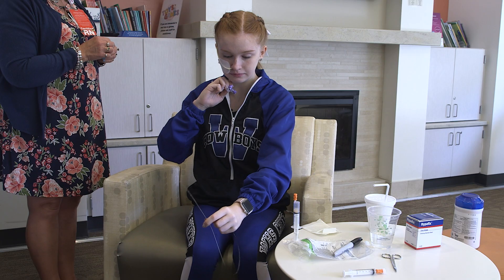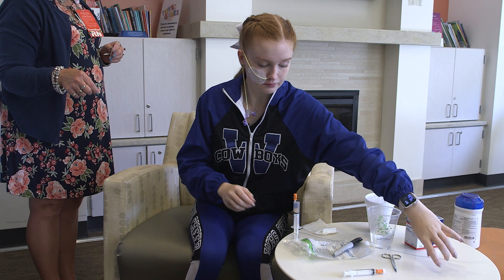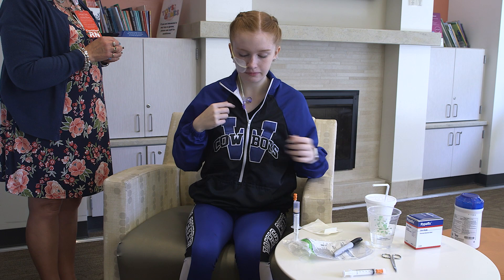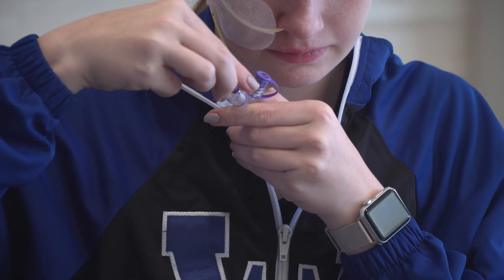If you use a tube with a stylet, hold the feeding tube at the patient's nose and gently remove the stylet guide wire from the tube by pulling with the other hand. However, remember: never reinsert the stylet guide wire into the NG tube.